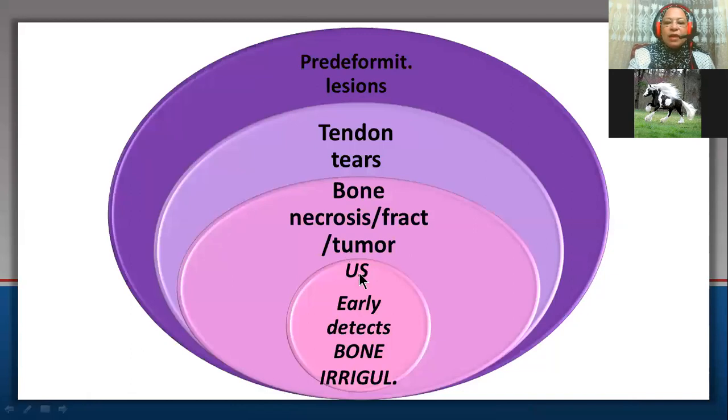Also, musculoskeletal ultrasound examination helped us to detect pre-deformity lesions like palmar plate avulsion, which is the first step in the development of swan neck deformity, especially in rheumatoid arthritis patients. At this stage with palmar plate avulsion, the patient could be treated conservatively to prevent occurrence of permanent swan neck deformity. Also, musculoskeletal ultrasound examination helped us to detect tendon pathology, whether in the proximal part all through the tendon or at its insertion.